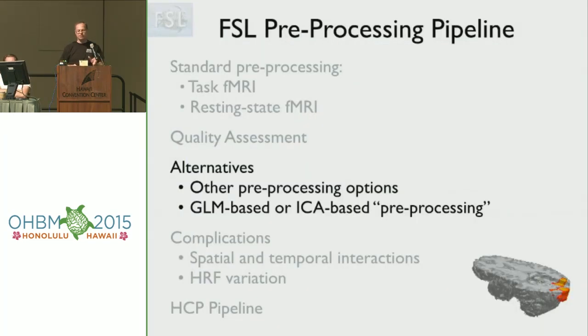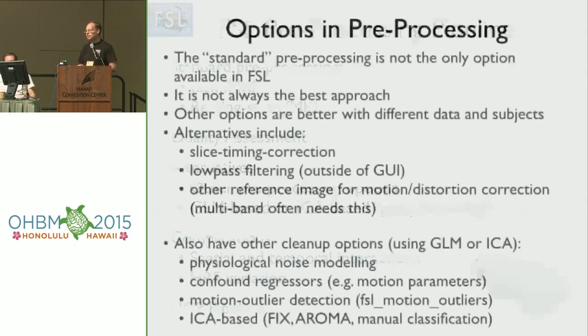So now I want to spend a few minutes talking about the alternatives to the standard pipeline and the standard default recommendations that we have. The reason I want to talk about that is that although we have defaults, and we have to have defaults, and there is a standard recommendation, it's really not always the best thing to do. And that's because MRI is such a flexible tool.